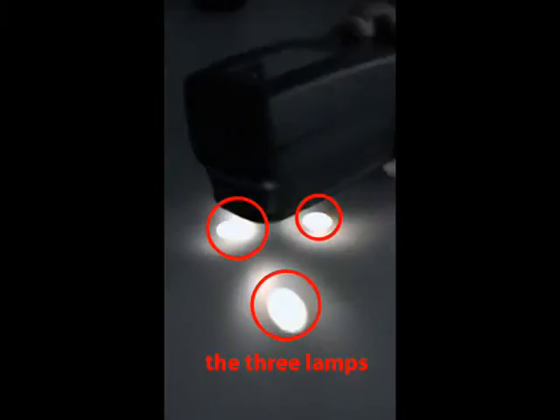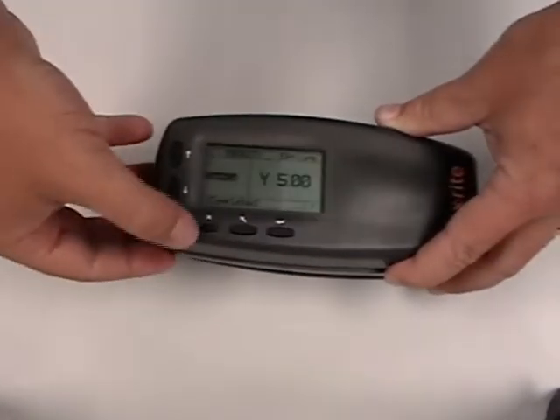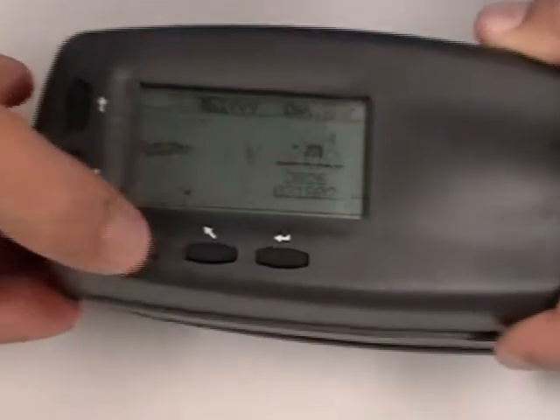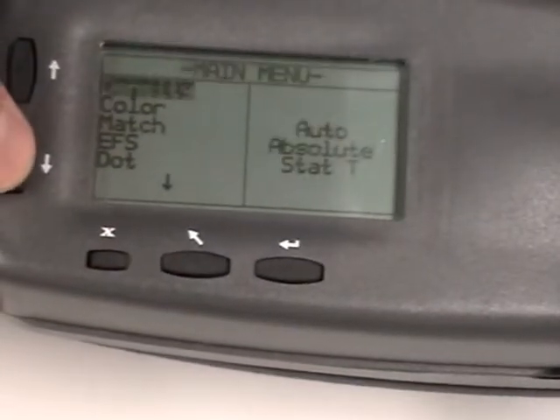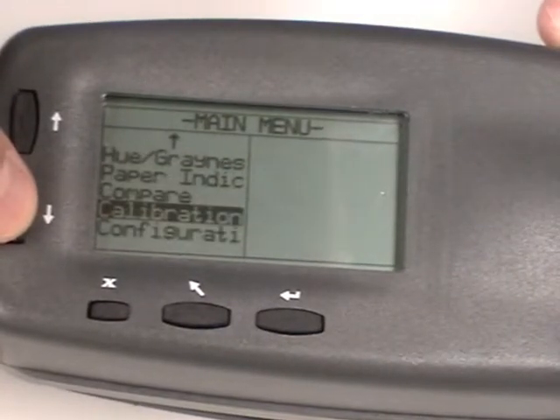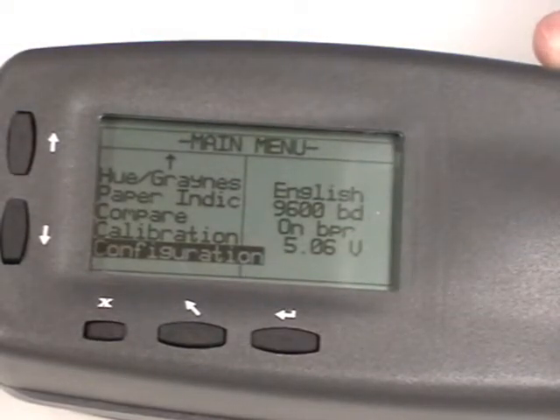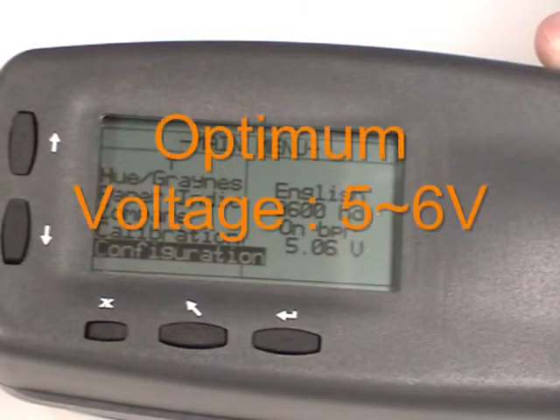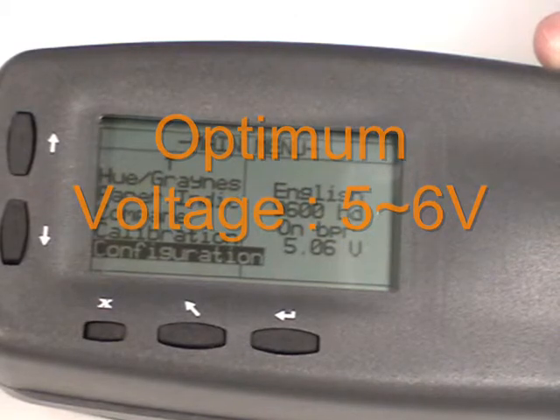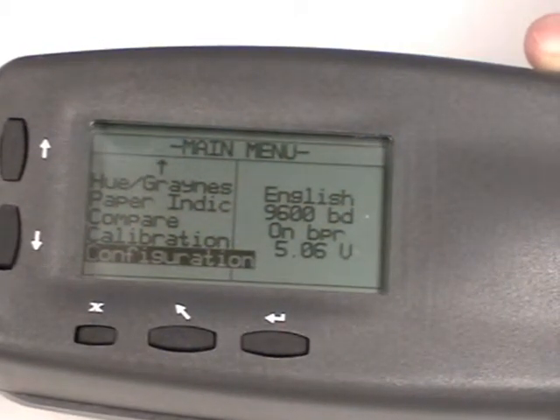You'll actually see three lamps. If all three lamps are there, the other check you can do is actually going into the instrument, pressing the X, getting back to the main menu, and slowly scrolling down until you get to Configuration. Once Configuration is highlighted, on the right at the bottom, you'll see the voltage. We want this between 5 and 6 volts. If it's below that, that can mean your battery is low and there's not enough charge to take a proper measurement.